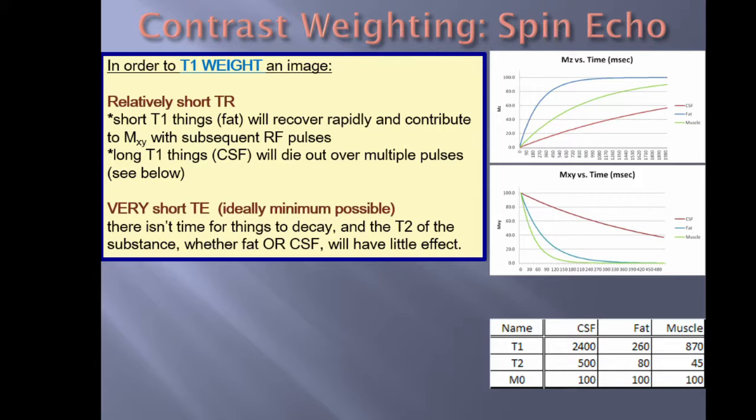Also keep in mind, in the real world, when we do pulse sequences, the machine does a preparation, so it actually does several pulses first and throws them away so that everything reaches equilibrium. Just keep that in mind.